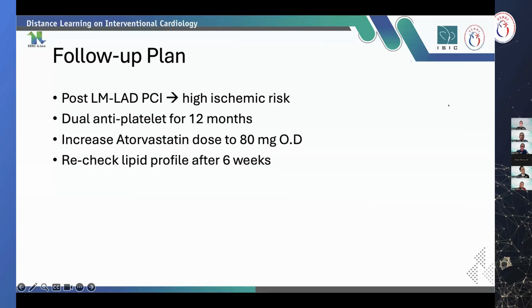But if my procedure is based on the angiogram, probably I will not touch the mid part of the LAD. Just put the stent, optimize the stent position, and finish the session. But we will need a close follow-up for the patient about their symptoms, and also we need to give optimal medical therapy for this kind of patient, I think.